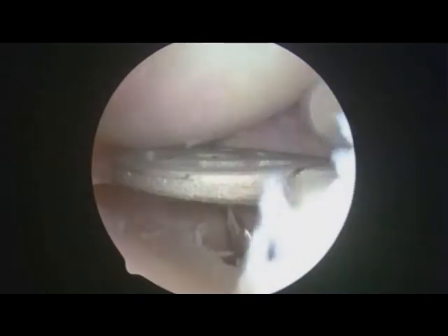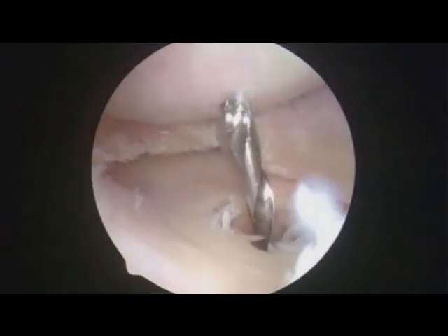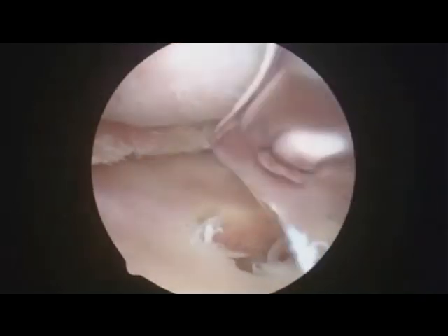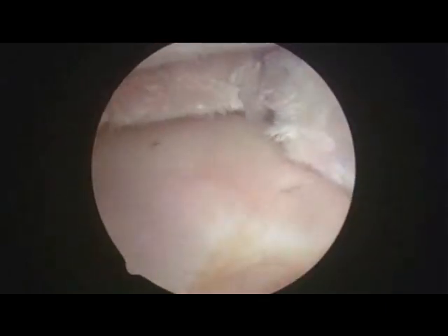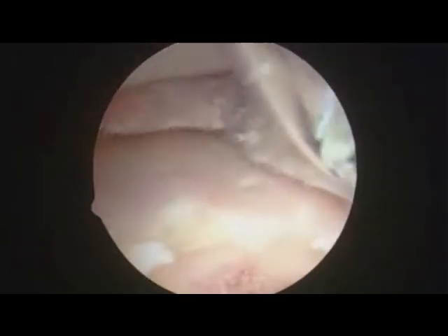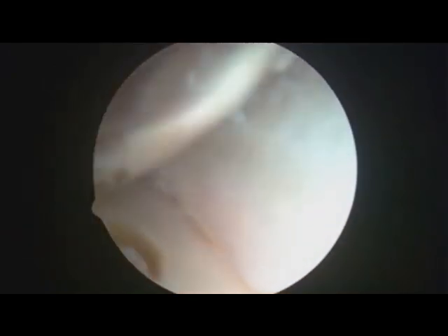What I do at this point is I take this implant out, and then we drill over top of it with a 6.5 millimeter drill to make our entry hole. So once we've made our entry hole, we have to determine the depth that we need to make our hole for our tibial implant, so that we have a special device which allows us to put the screw into a certain depth, and we can mark it.